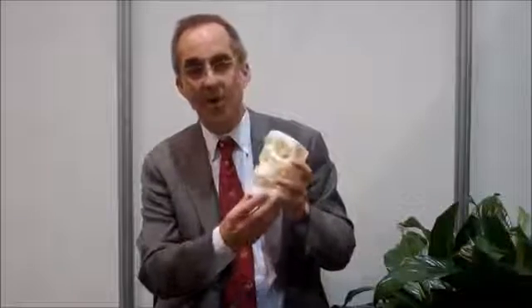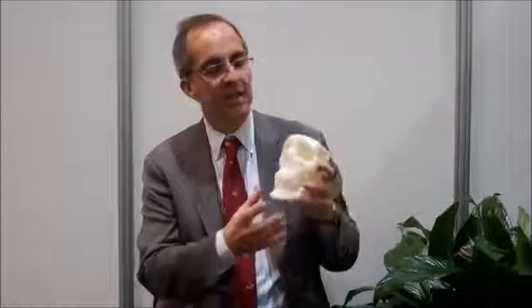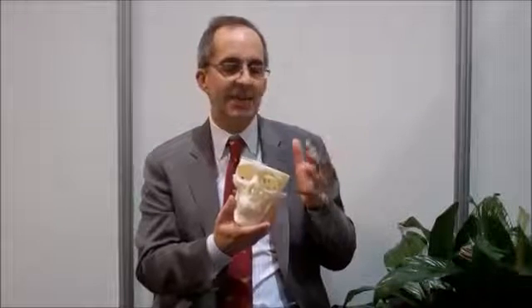So in our face transplant program, the imaging begins with wide area detector CT. We use 320 detector row CT to acquire the CT data for all of our patients. This is actually a 16 centimeter model corresponding to the field of view for our CT scans. And we're able to capture the key components of the face in virtually all patients that we've done using that technology. From the CT data, there's really two ways that you can analyze the images.